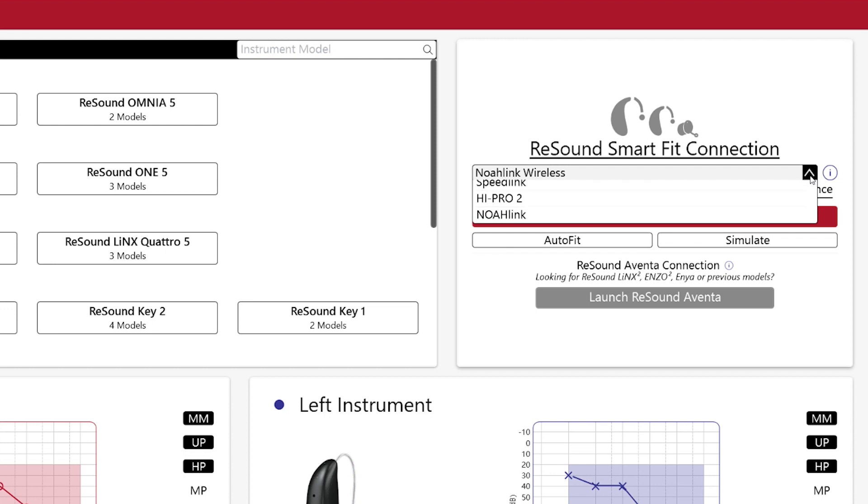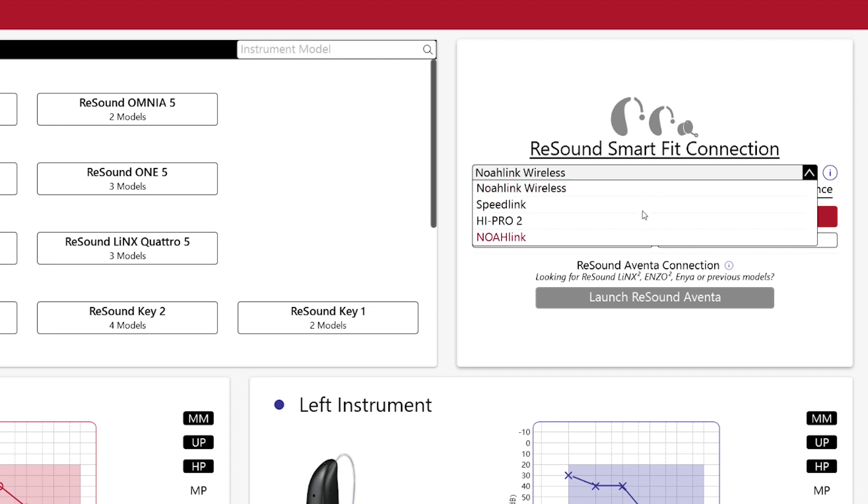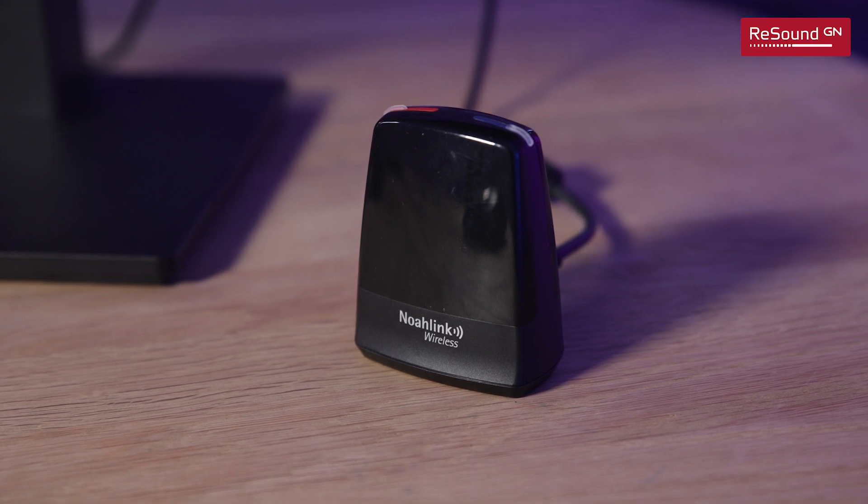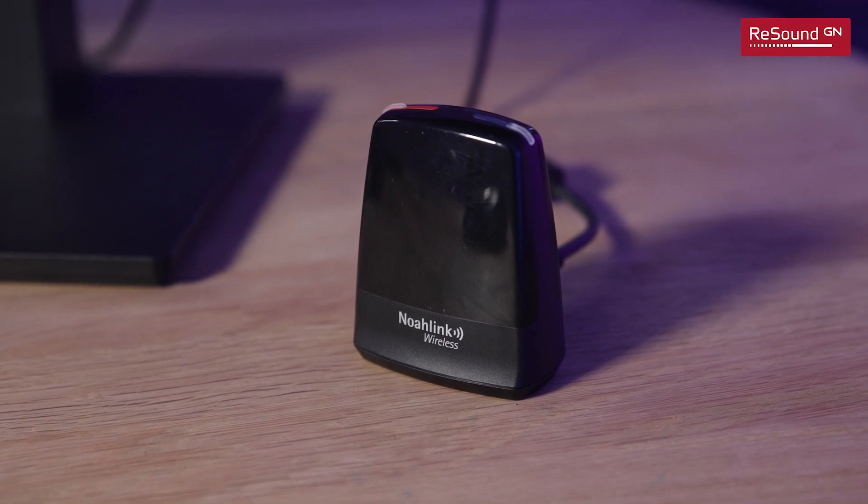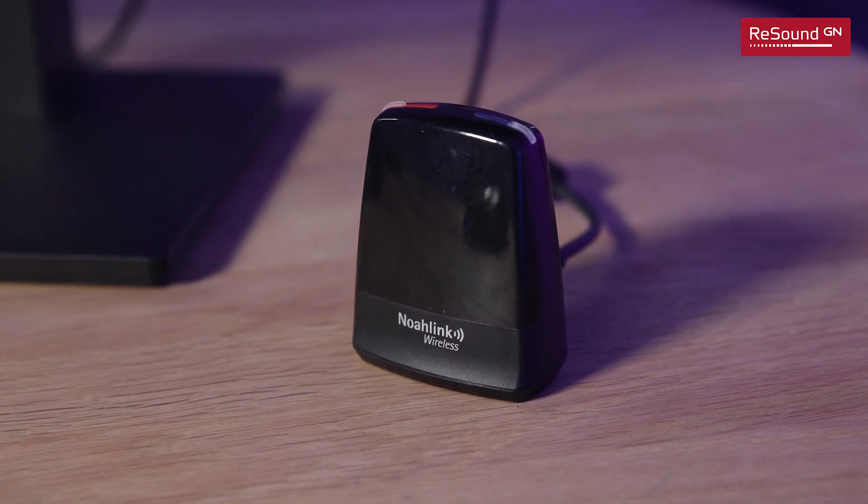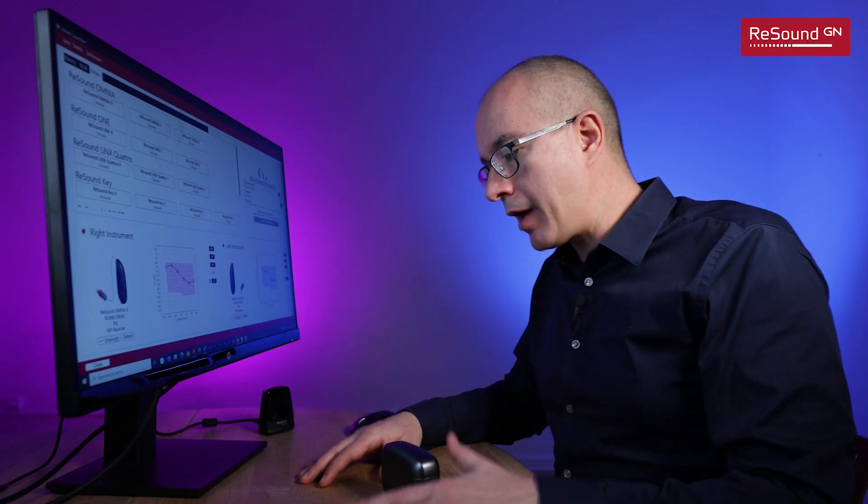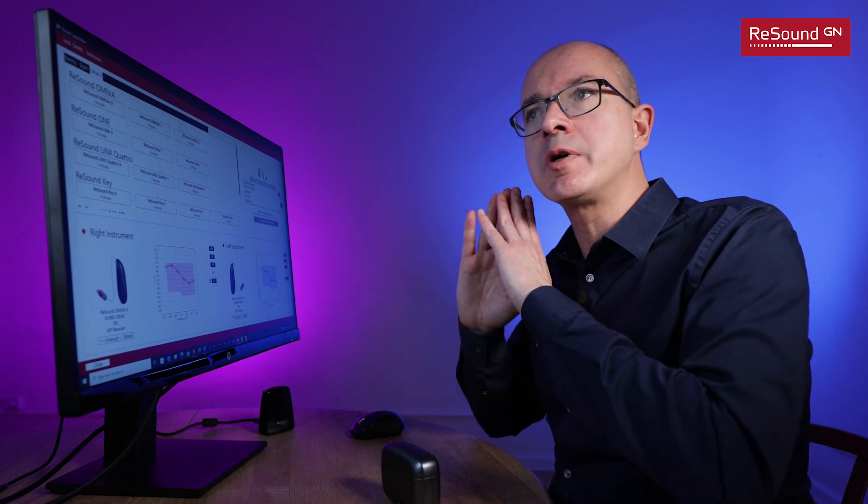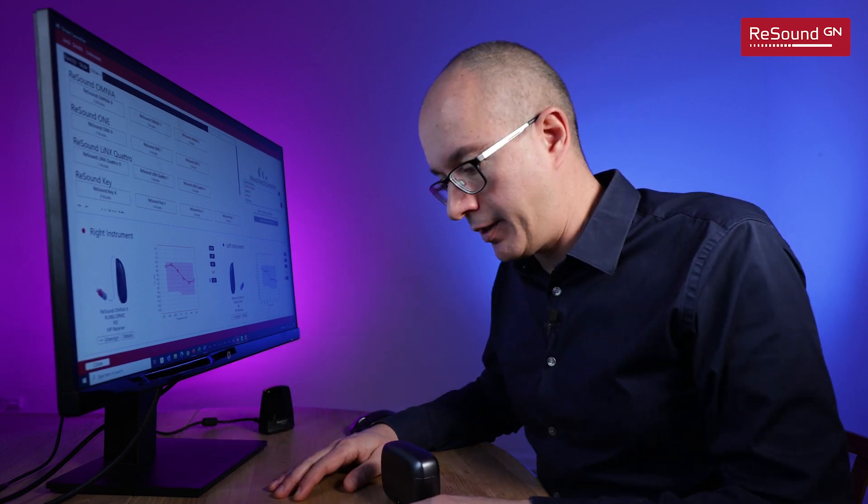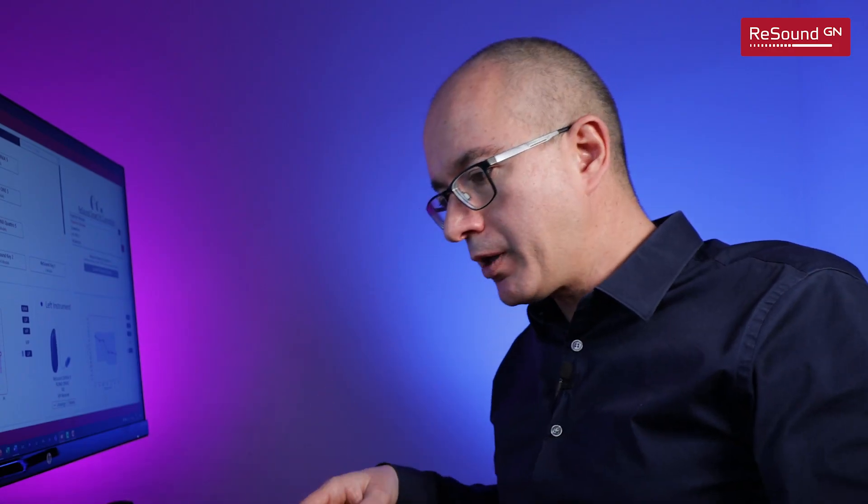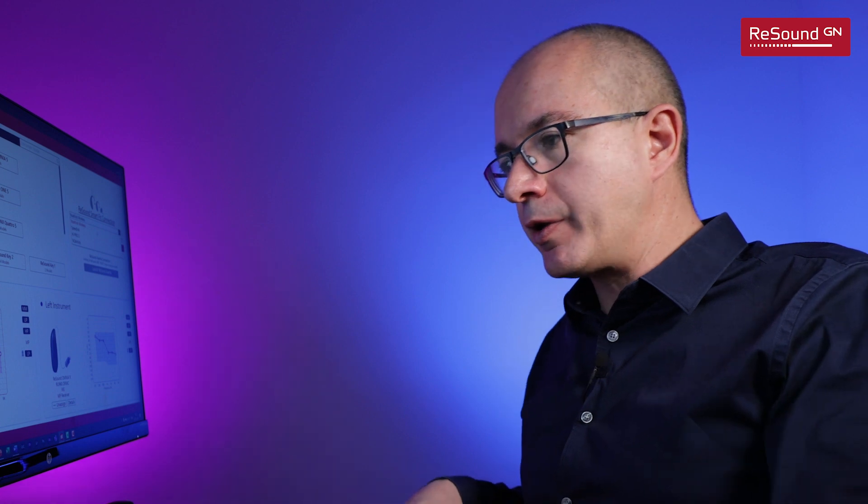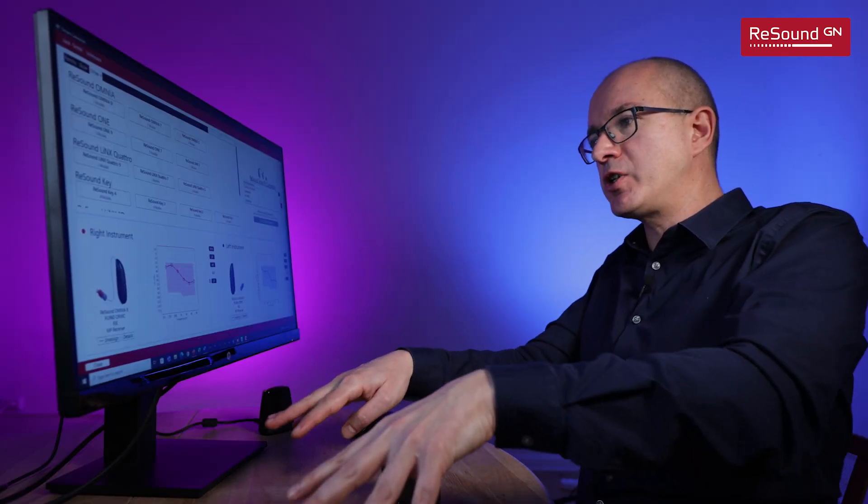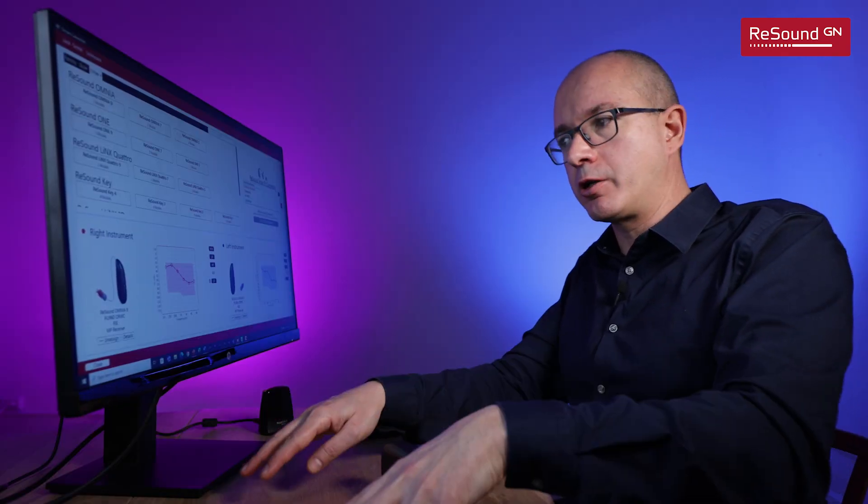In my case I knew that I wanted to fit the new ReSound Omnia Mini RE and for that I can go directly to section 2. Here we can specify what is our programming interface. In our case I'm using NOAHLink Wireless connected to the computer through a USB cable and I love wireless fittings.